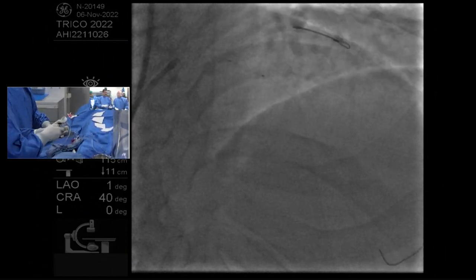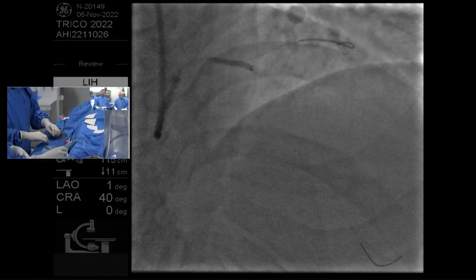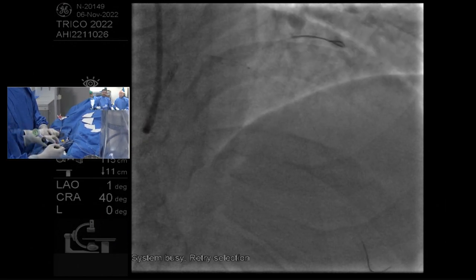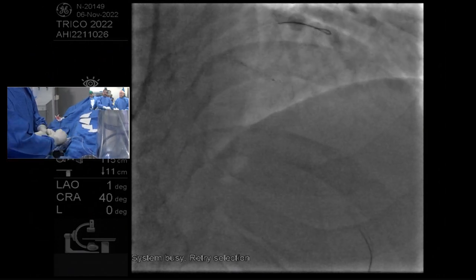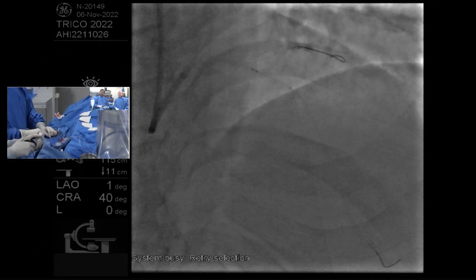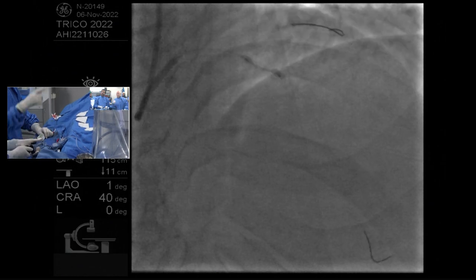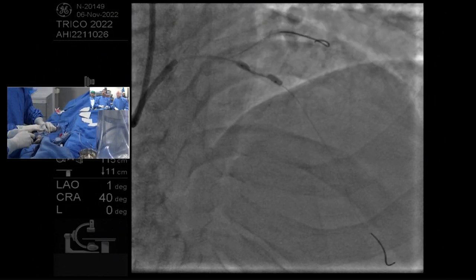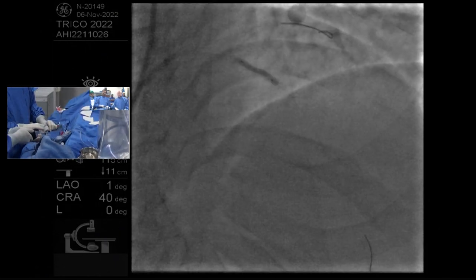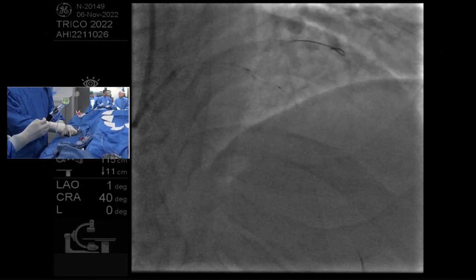Based on the data, when you can see moderate calcification within the angiograms, all bets are off in terms of how severe it actually is. If you've got a calcification that's visible on an angiogram, 50% of the time it's moderate, 50% of the time it's severe. Right? Yeah, here. And once again that engenders the idea of imaging it to really define both the calcium length, calcium bulk, width. Look at that. That's impressive. That's not what you saw in the other angiogram. So it looks like it just opened up for you. Okay, so shall we do some imaging? Okay, absolutely.